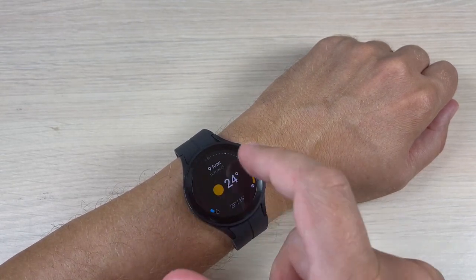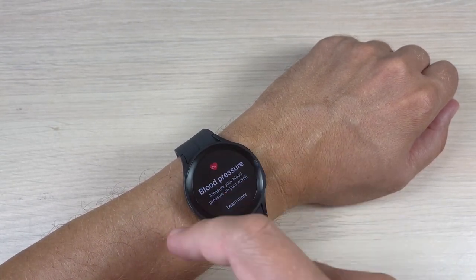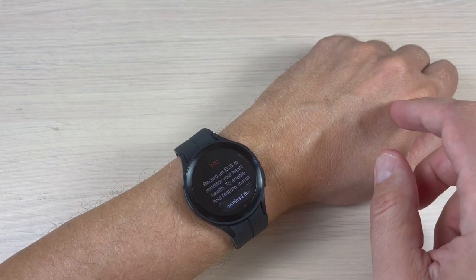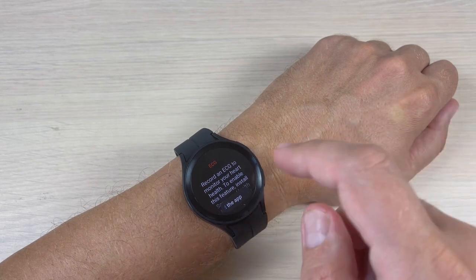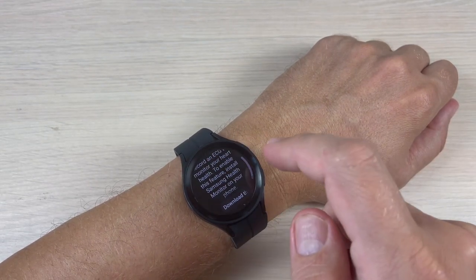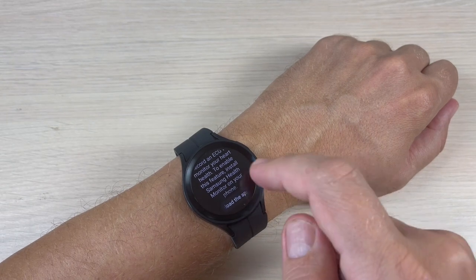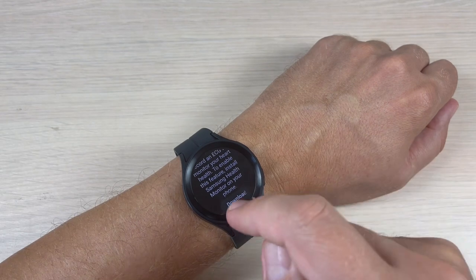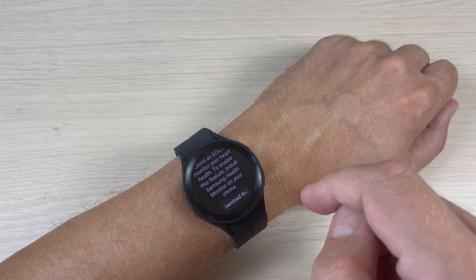Now press on 'Learn More' and record an ECG to monitor your heart health. To enable this feature, install Samsung Health Monitor on your phone. Okay, now press 'Download the App'.